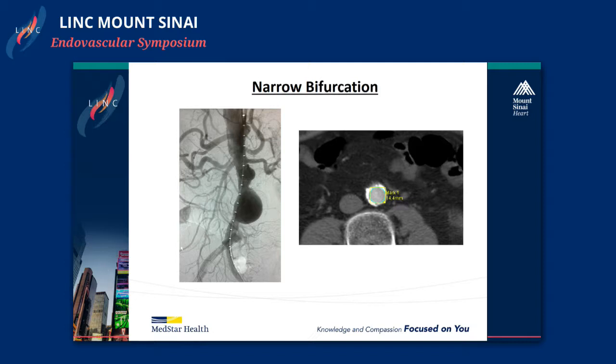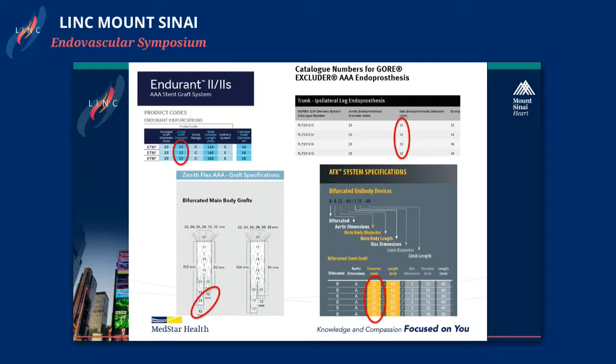It's important at least to delineate it somewhat. You have that long, narrow aorta that can go for some length, versus that napkin ring focal area of calcification that exists right at the aortic bifurcation. And I think they're a little bit different, and I'll talk about it a little bit later.